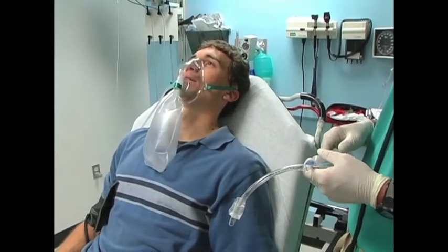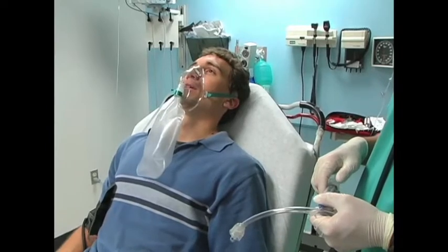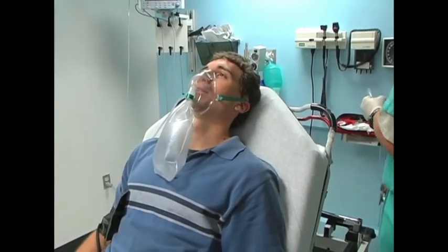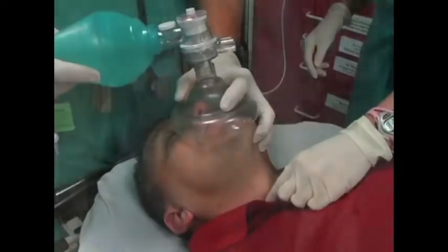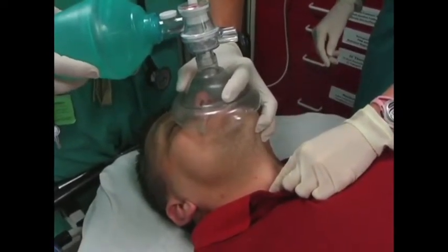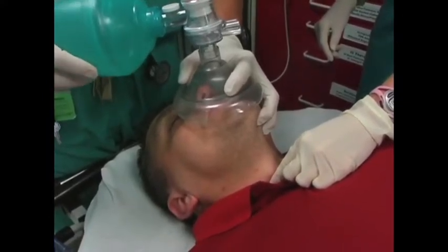Spontaneously breathing patients should be pre-oxygenated with a non-rebreather oxygen mask at maximal flow rates for 3 to 5 minutes. Sir, go ahead and take 4 deep breaths for me. Fully cooperative patients should be asked to take 4 maximal inspirations. Non-breathing patients should be ventilated using a bag valve mask device and using cricoid pressure to prevent aspiration.